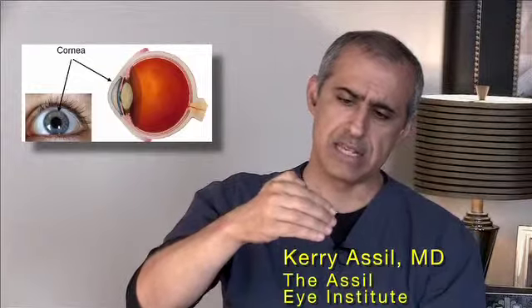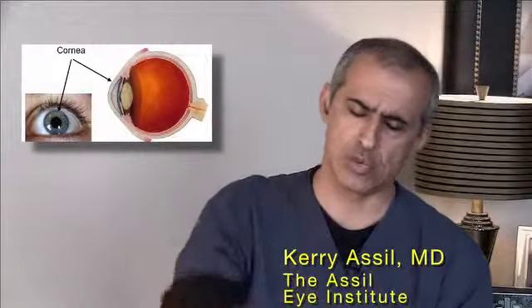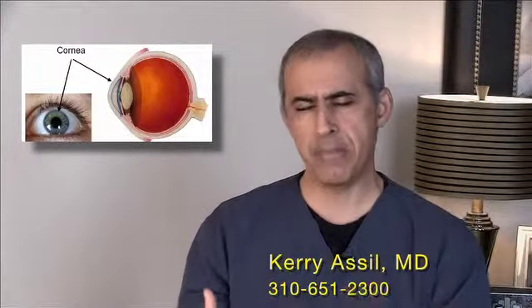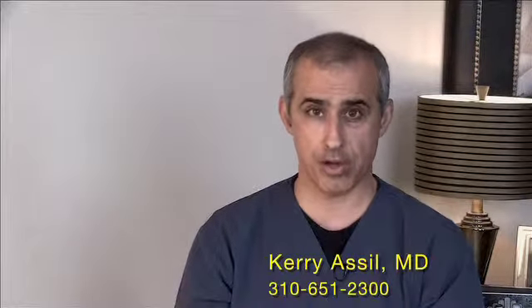That outer lens, if it has any misshapen qualities to it, will blur vision. In order to know how to repair or remedy that, we can do measurements with what's called corneal topography.